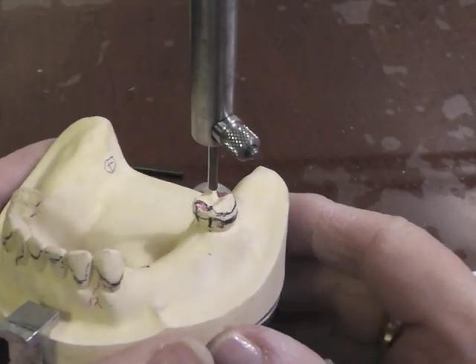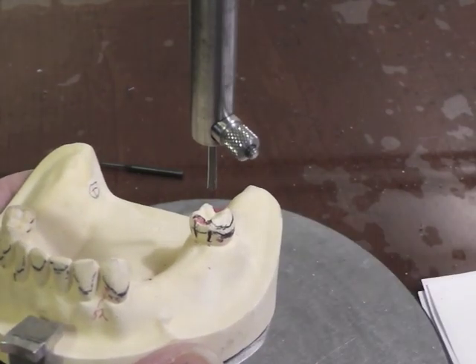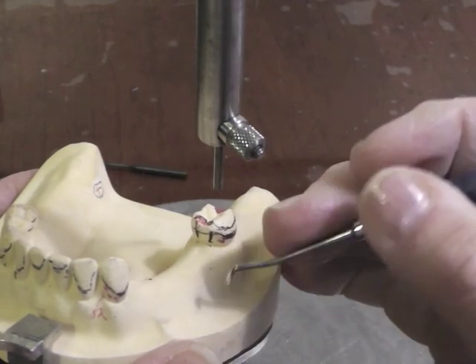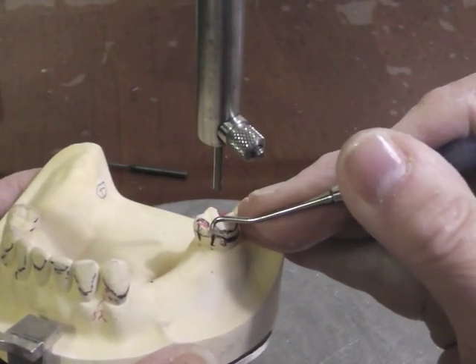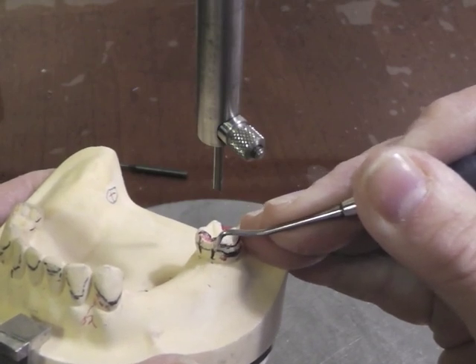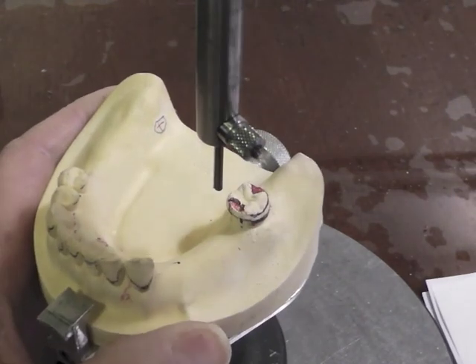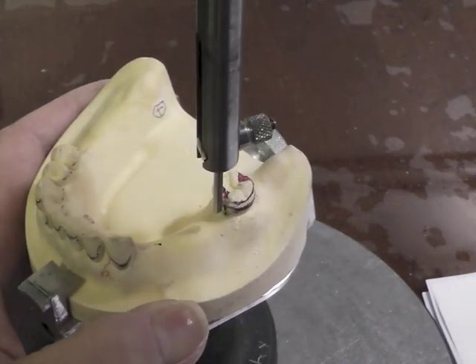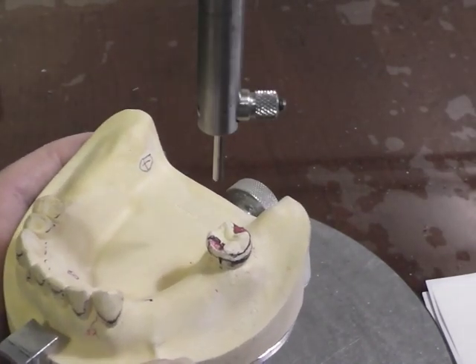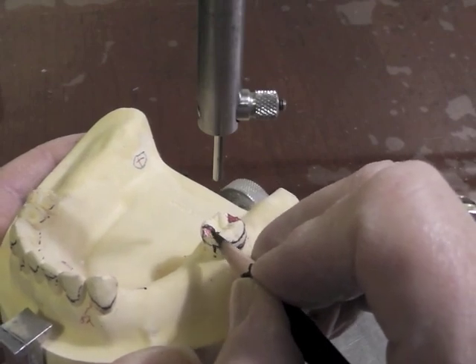I cleaned this clasp up a little bit to give you a better look at it. If you took this arm below your survey line, which is often the case, then you must do a little bit of adjustment and resurvey to make sure that your line is now apical to your direct retainer arm. So make any modifications additionally on that tooth that need to be made.